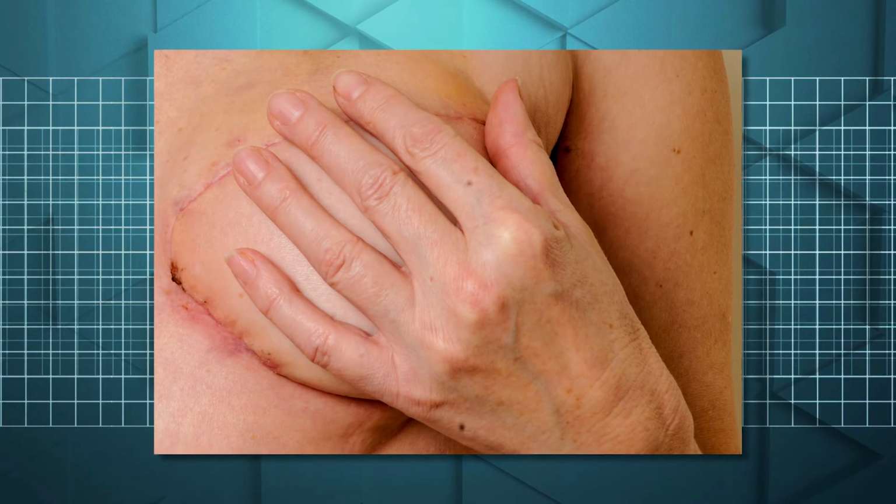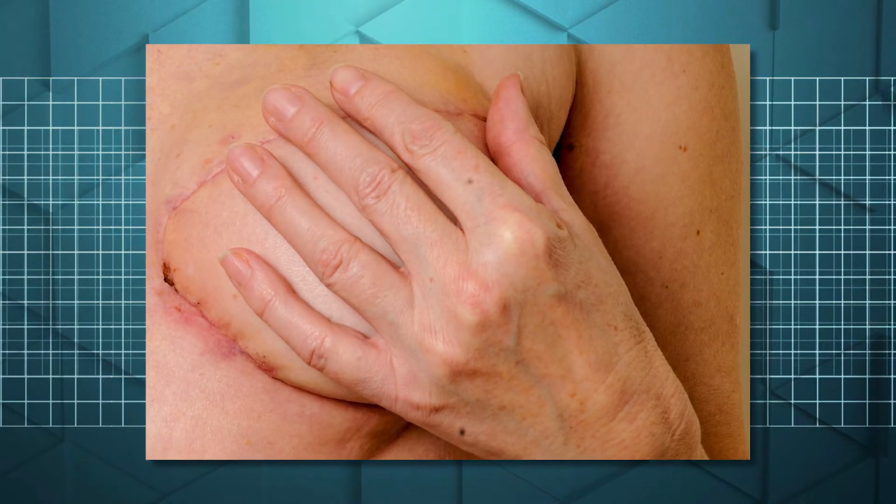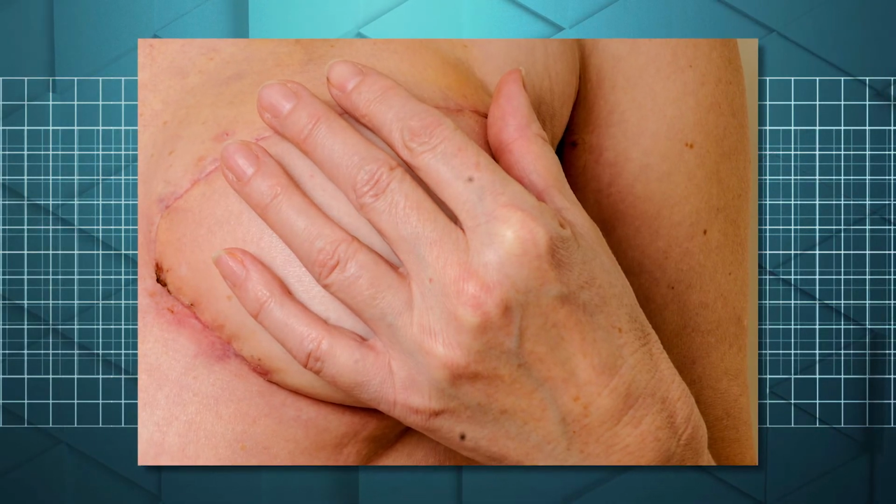You know, actually the trivia of high profile, Ellery, is that high profile implants were originally built for breast reconstruction patients, because they had their breast tissue removed, so they needed more volume in order to fill it up. The average breast, even if it's somebody that thinks they have small breasts, probably has 400 cc's of breast tissue already, and then you're adding the implant to the breast tissue.